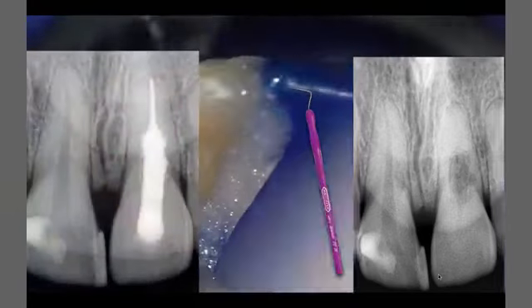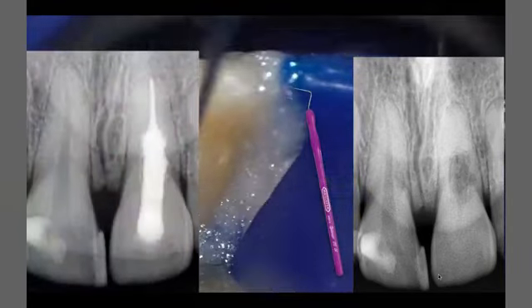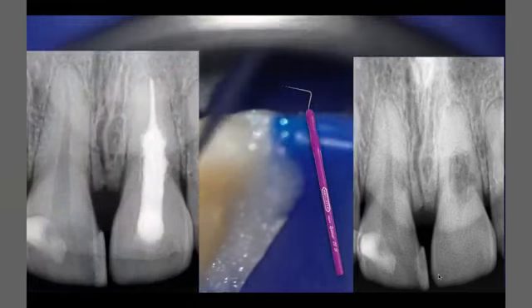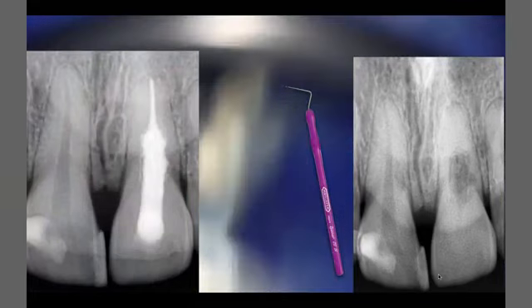Here is the post-op X-ray. And as I told you, I did the filling with gutta-percha and sealer for the internal resorption, because there is no communication with the surrounding tissue. So I think this is the final case for today.